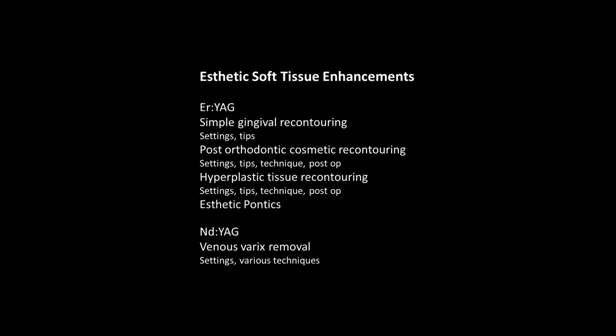Venous varix lesions that we find on patients' lips and on their tongue. Like I said, nobody out there is treating those, so it's kind of a niche market as well for us.